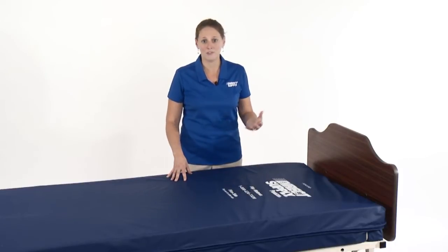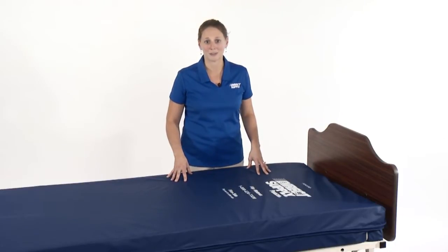With this in mind, we've developed the Panacea Flip Mattress. This design gives a resident a choice in their own comfort while conserving storage space.